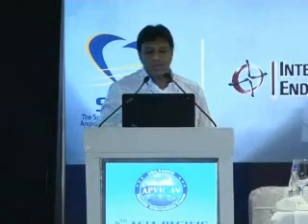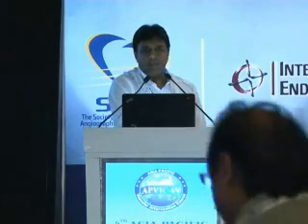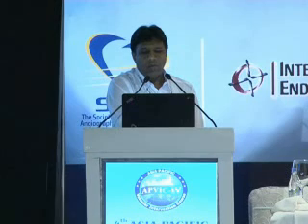A stent is simply compressed over a stent delivery catheter and covered with a sheath. Stent deployment is achieved by pulling back the sheath. Stent diameter should be 1 to 2 millimeter larger than the reference vessel diameter, with adequate stent apposition with the vessel wall. With the self-expandable stent, some degree of foreshortening must be taken into account when choosing. It is more difficult to place with absolute precision. It generally comes in longer lengths than balloon mounted stents, and their ability to continually expand after delivery allows them to accommodate adjacent vessels of different sizes.